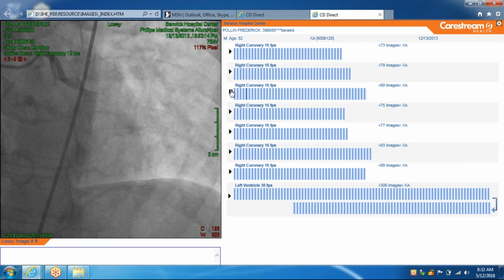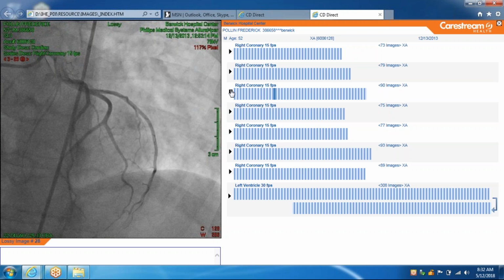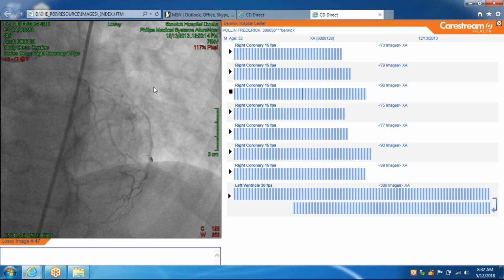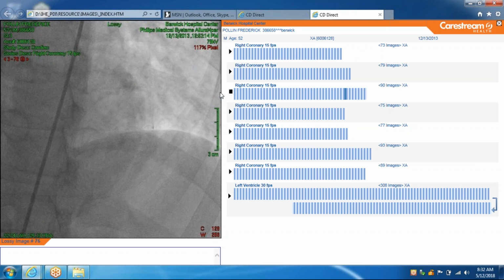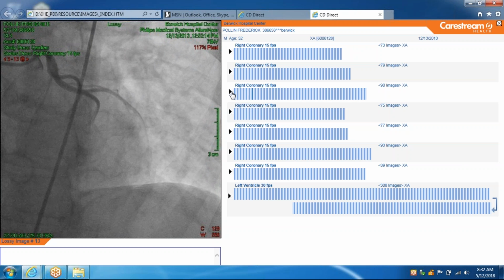All right. So this is the left system now. Okay. So again, the left main is going to divide into a left anterior descending coronary artery and a left circumflex. That's the usual anatomy. So this is your left main, and with this view, this is your LAO cranial view. So LAO, the left anterior oblique, 22.7 degrees, so it's tilted to the left, but it's more towards the head. Okay, about 25 degrees. And in this view, this is the left main, and the left main divides the LAD.